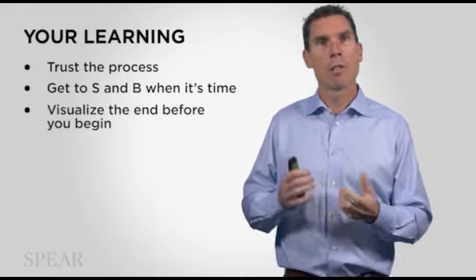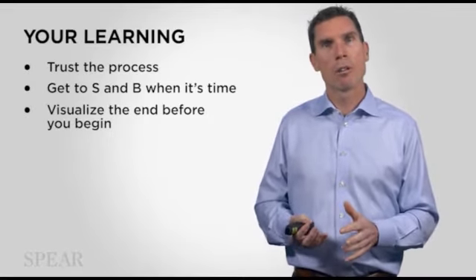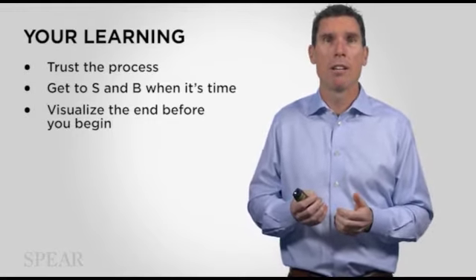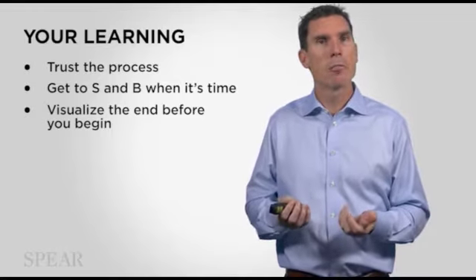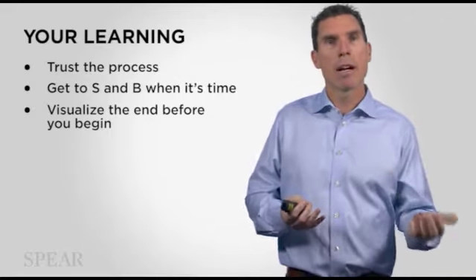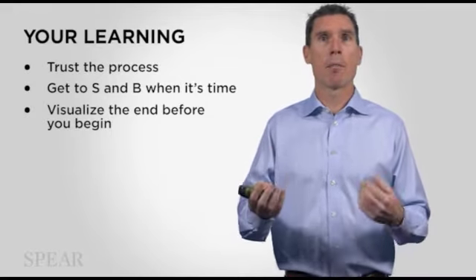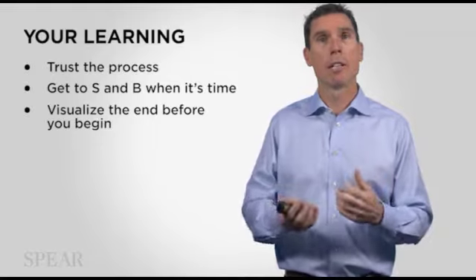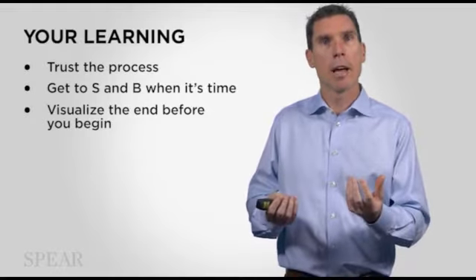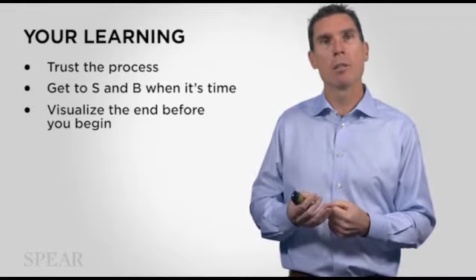And then finally, my hope for you is that you really have an appreciation for visualizing the end before you begin. Doing some of the work yourself on the models helps determine different, appropriate ways of phasing treatment, right? For instance, the upper left implant. How many different ways could we have done Shannon's upper left implant? When could I have taken the impression? When could I have actually placed the restoration? There was a time where I thought to myself, you know what, I don't want to wait for it to finish integrating. I'm ready to do the rest of the dentistry. I could have done everything else and then just plop that implant in last, couldn't I? Just that last little piece of the puzzle, even months and months after I was done. I had so many options for that.